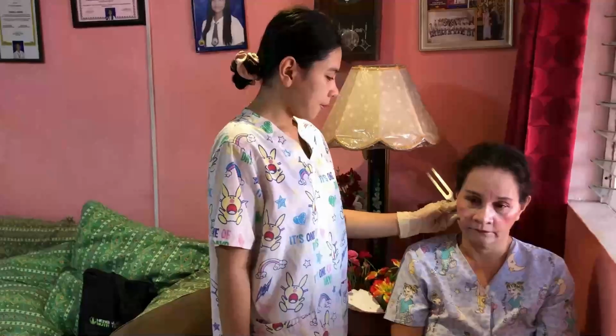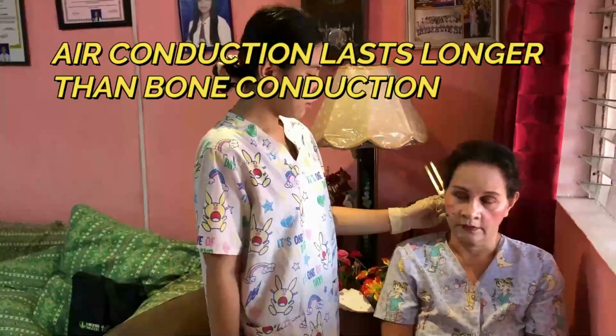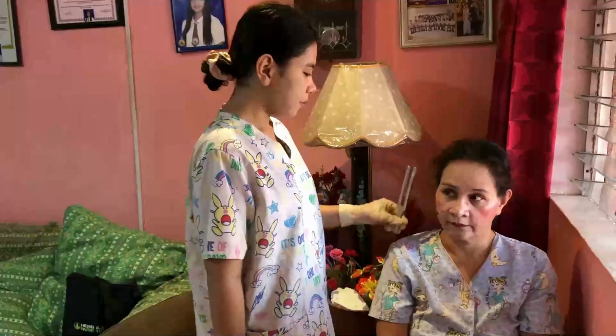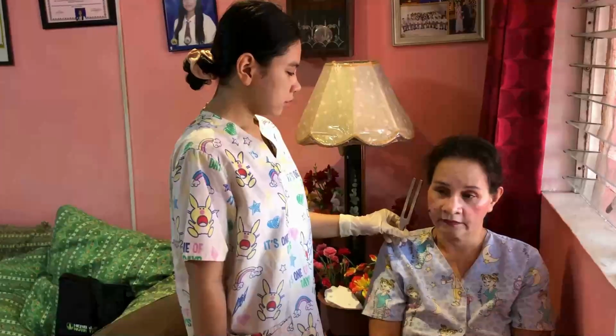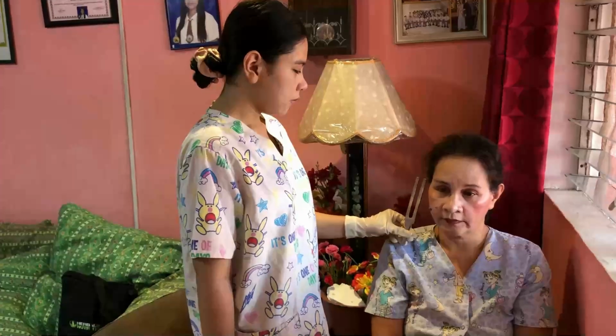For the Rinne's test, ma'am, I will be putting this tuning fork near your ear and just tell me when you can no longer hear the sound, okay? I can hear. How about that? You cannot hear it anymore? I can no longer hear. How about this? I can hear. You can no longer hear now? I can no longer hear. Okay.